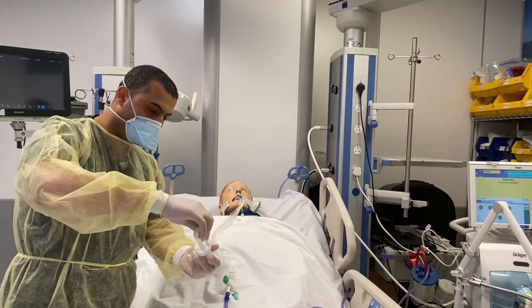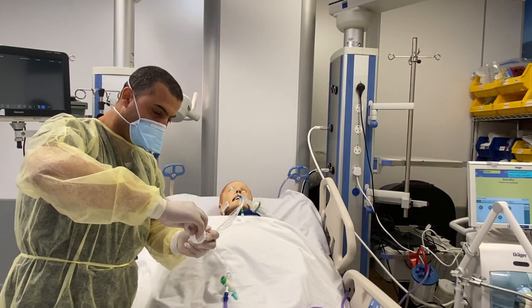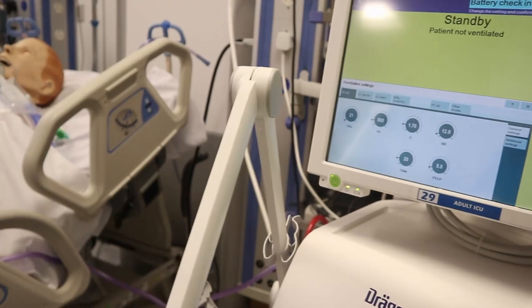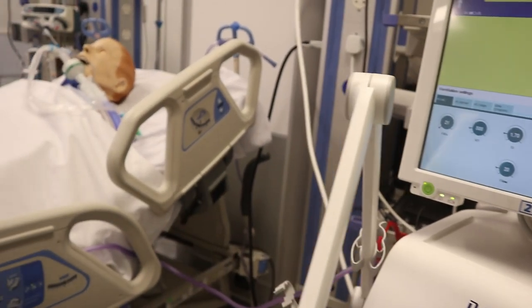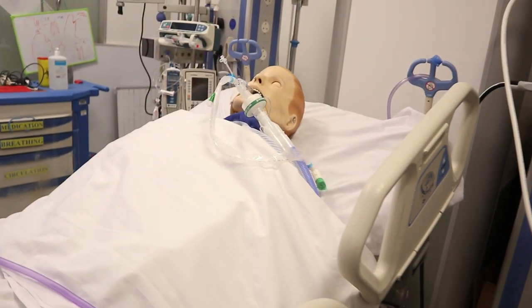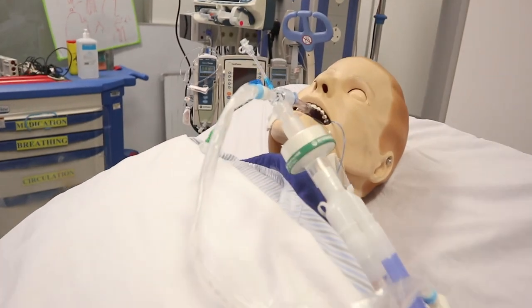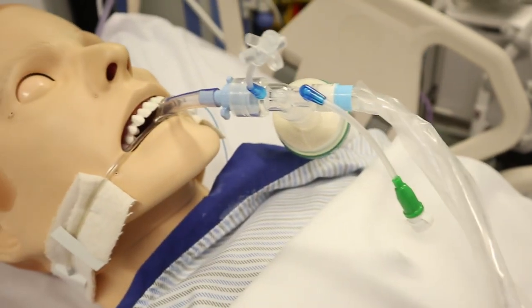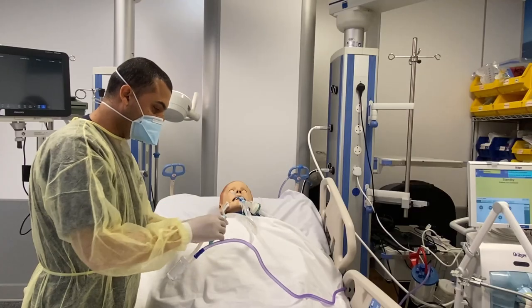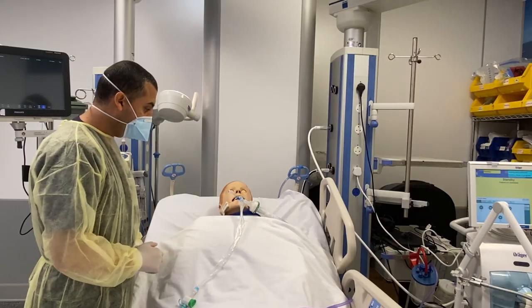Testing lower respiratory tract specimens is also an option under certain clinical circumstances. For example, those receiving invasive mechanical ventilation. A lower respiratory tract aspirate or bronchoalveolar lavage sample should be collected and tested as a lower respiratory tract specimen.